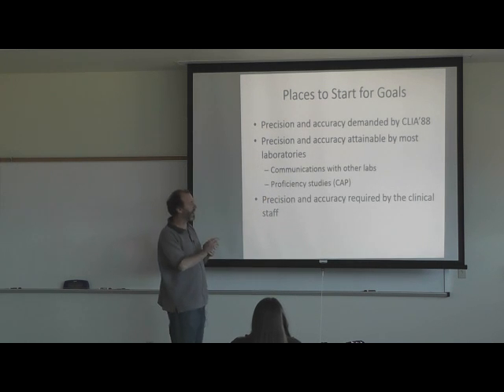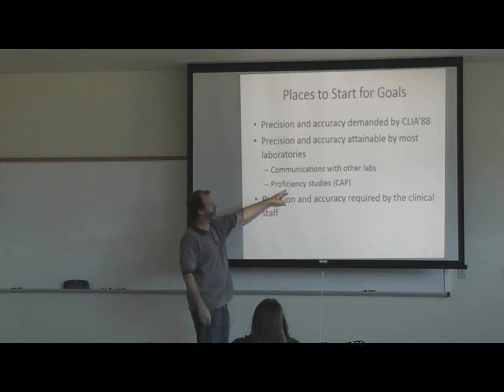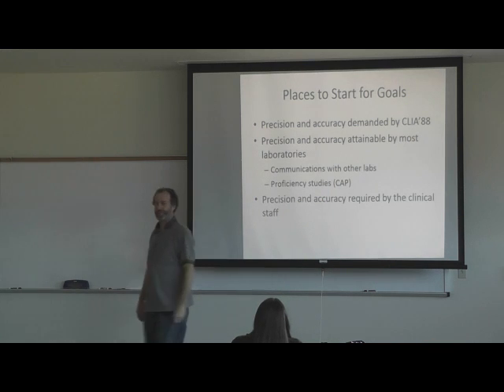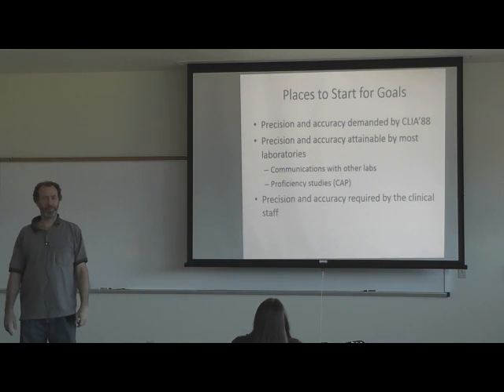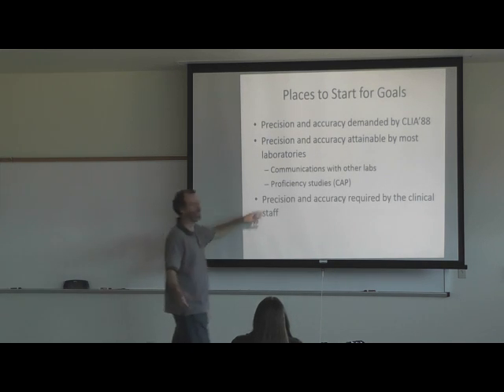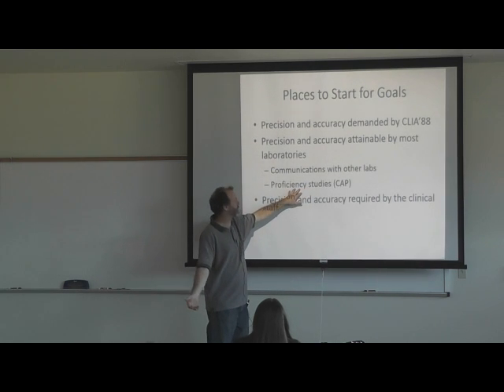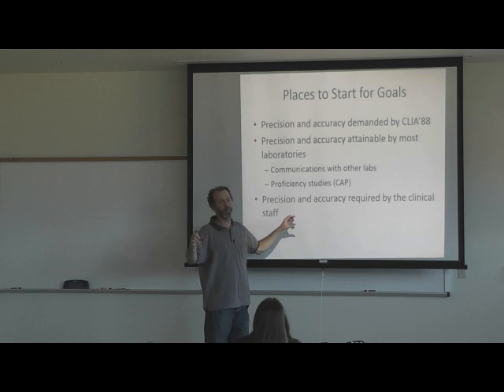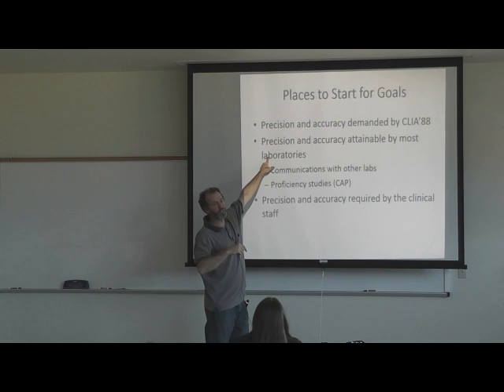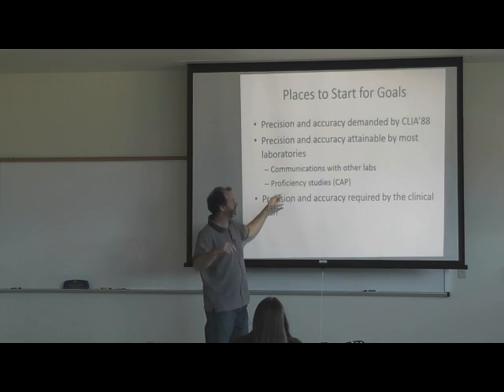So those are required by labs to maintain their accreditation. They have to do these proficiency studies where you get these outside groups like CAP. Anybody have an idea what CAP stands for? Something American Pathologists. College of American Pathologists. That's one of the people that does these proficiency studies, and that's where they have a set of tests that they send out to all the different labs. So they do these group means and group standard deviations, and you see how well you are compared to everybody else, where you lie.